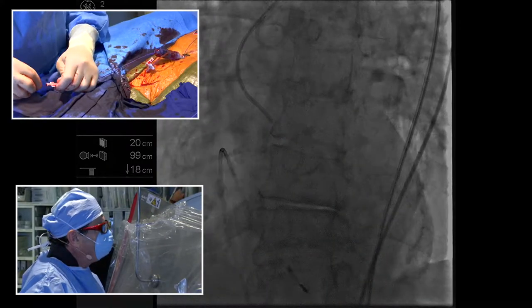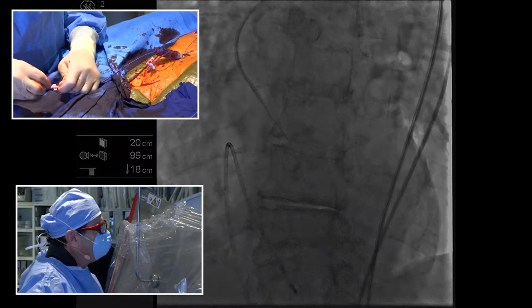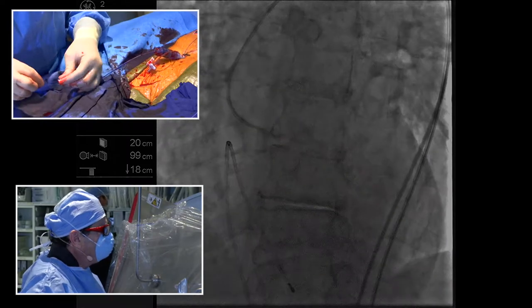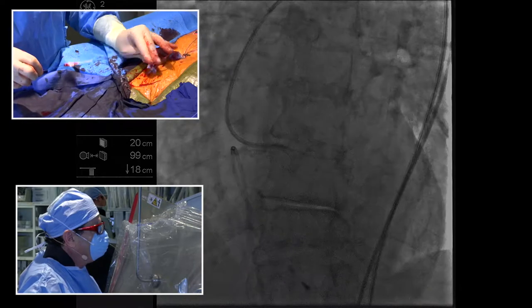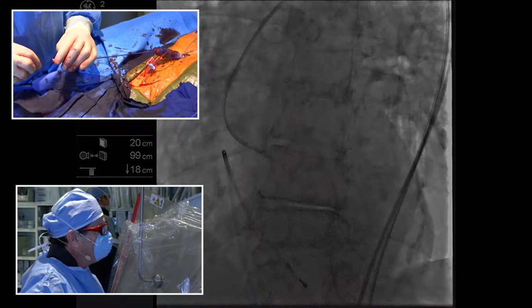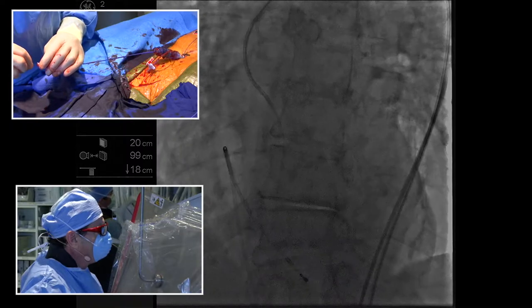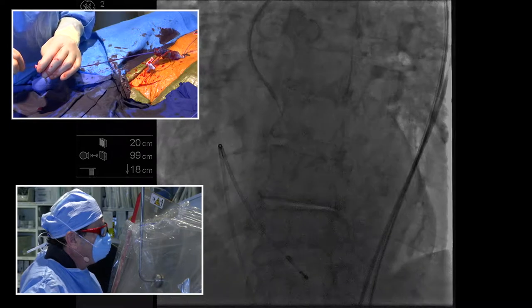But what catheter besides AL2? AL2. This is the AL we got. Yeah, this one's not that horizontal. This one shouldn't be that hard, actually. Maybe I'm just really bad this morning. I mean, I just can't seem to find the hole here. That should really do it, right about there. And that's where we usually see it, right there.